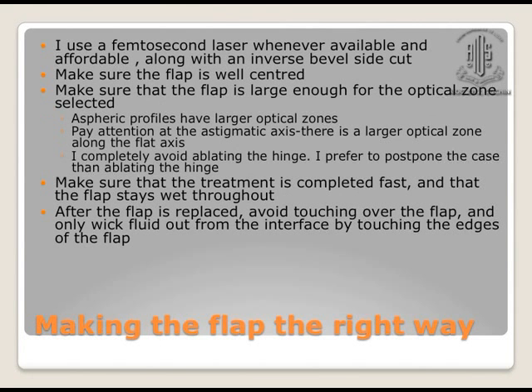I use a femtosecond laser wherever available, so making the flap correct is very important, but affordability is always an issue. So it is not necessary to use a femtosecond laser only for making a flap, but if it is affordable, it is offering a lot of advantages today. You can have a very precise flap of a very precise thickness, and the inverse bevel side cut helps you to retain the biomechanical stability, and also induces less aberration.